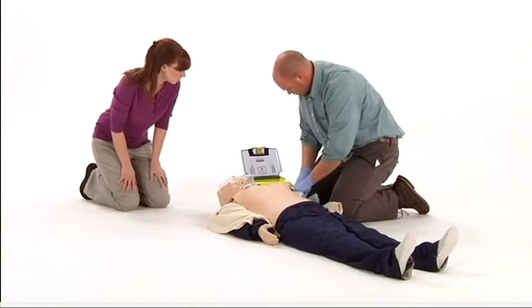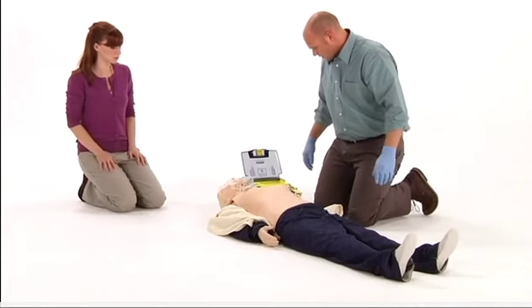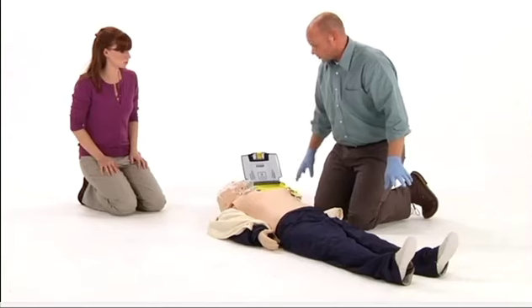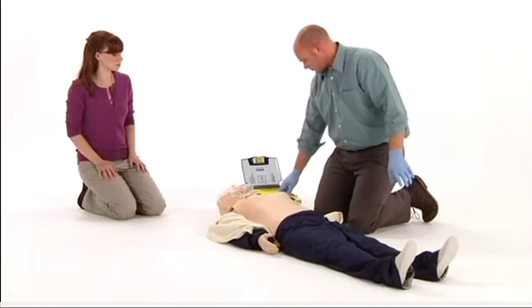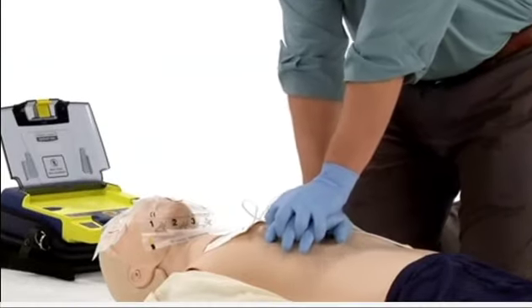Analyzing heart rhythm. Do not touch patient. Do not allow yourself or anyone else to touch the person while the AED is analyzing. Shock. Move away from the patient. Make sure that no one, including you, is touching the person. Press the red flashing button to deliver the shock. Shock delivered. It is now safe to touch the patient.